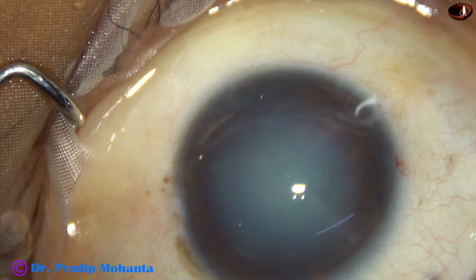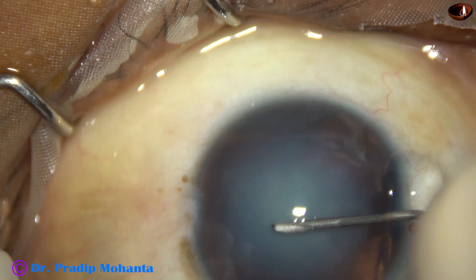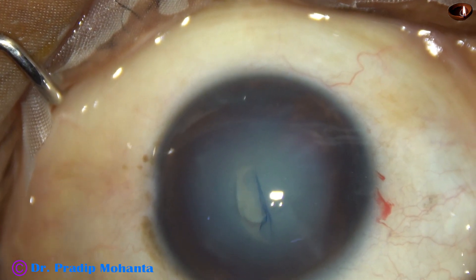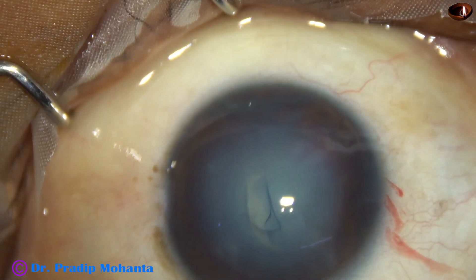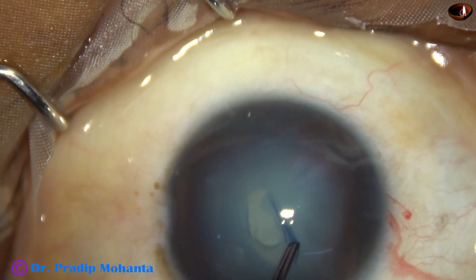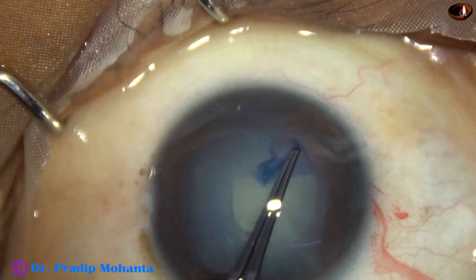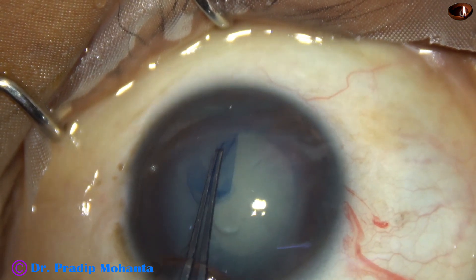The patient is a lady of 46 years. Several years back, she sustained blunt trauma in this eye. And now, capsulorhexis — I have used a cystitome to raise the capsular tag. And now, I use Utrata forceps to do the rhexis from 1 o'clock to 7 o'clock.